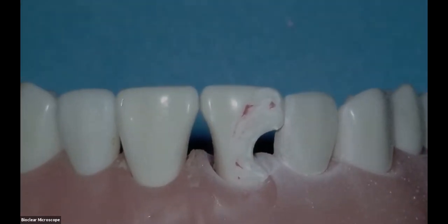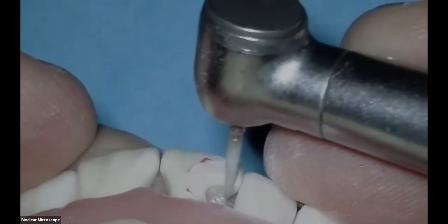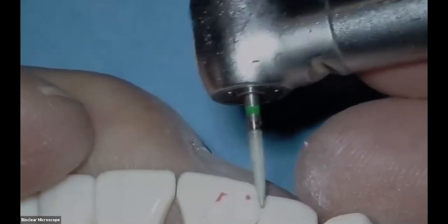And then you can also cut this, God, my 3 matrices just ran away. You can also cut this with the standard burr, but it's a little bit harder to do because this burr is convex and we have to be very active with our hands to create a convex radius bevel. So you can use the same burr, but it's a little bit more challenging.